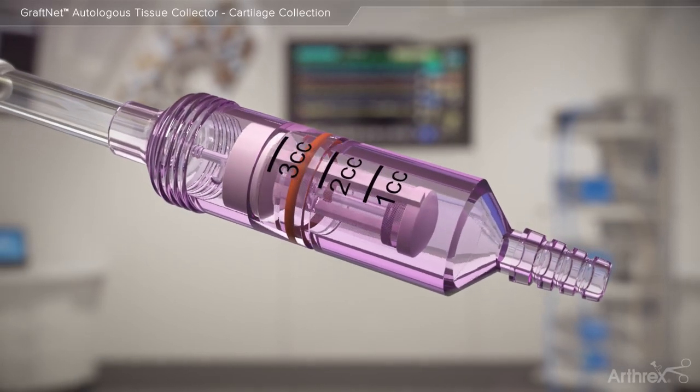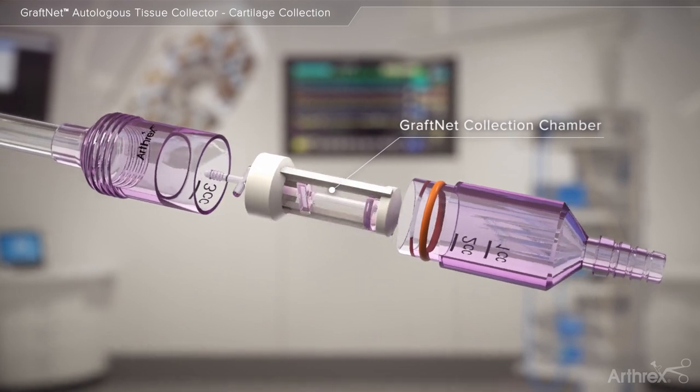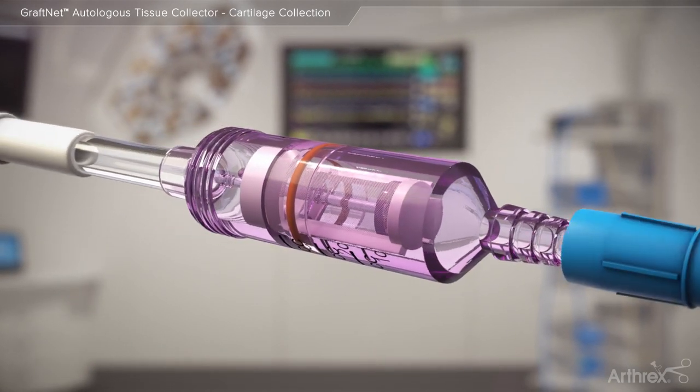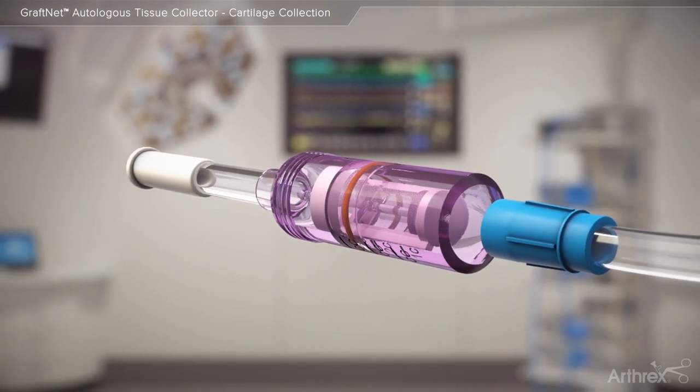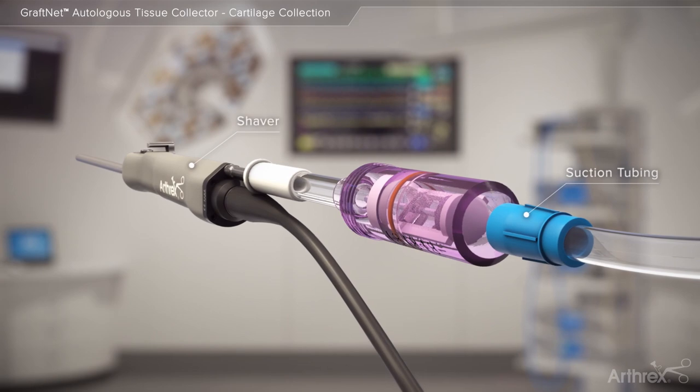The suction-activated GrafNet device is designed to collect autologous tissue for a multitude of applications. When connected in line to suction and an arthroscopic shaver, the GrafNet may be used to collect particulated autologous tissue into a sterile, filtered chamber.